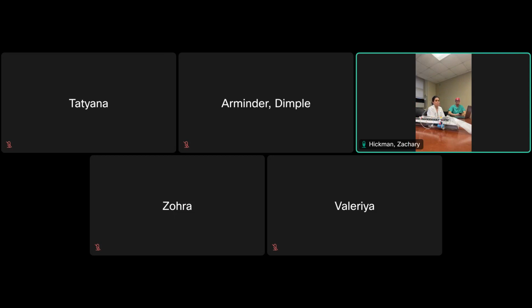Just before we get to that, in the steps, obviously once you drill the hole, you have to puncture the dura and then put the catheter in. You skipped those. Yeah. And then usually we're going to about 6.5 centimeters at the outer table of the skull, sometimes 7, or 7.5 if there's a lot of shift. You might need to go a little bit deeper.